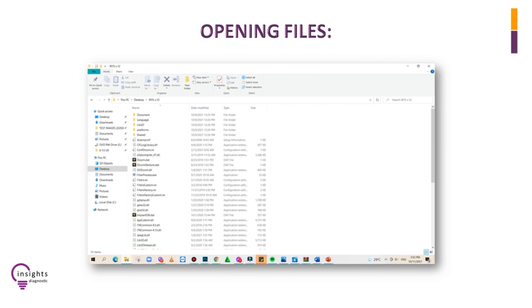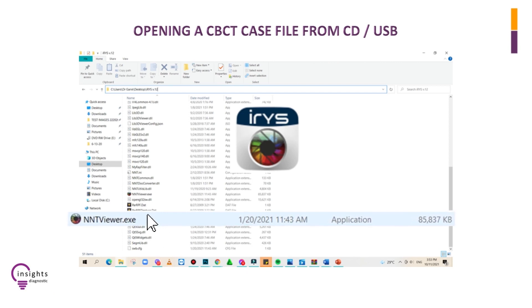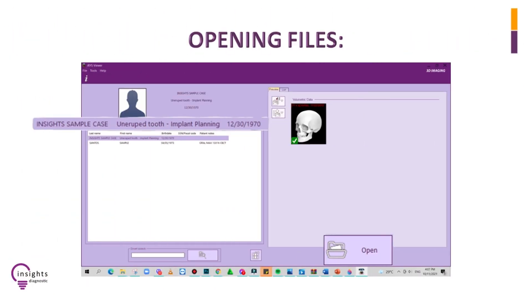Upon opening the USB or CD, you will see files and folders. Look for nntviewer.exe and double-tap or double left-click on NNT Viewer. Click the name of your patient or the desired case — in this case, we have Insights Sample Case.